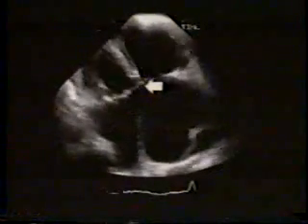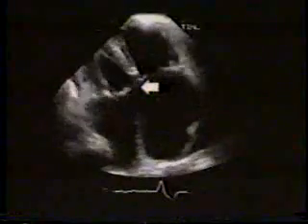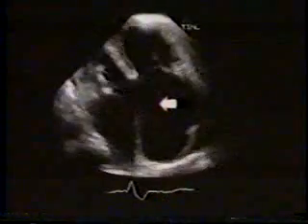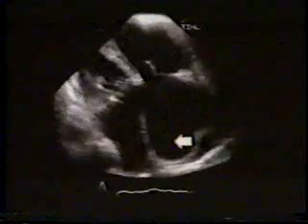In real time, note marked dilatation of right ventricle, normal size and function of left ventricle, insertion of both AV valves at the crest of the ventricular septum at the same level, large ostium primum atrial septal defect, and incidentally noted is a large eustachian valve in this position as well.